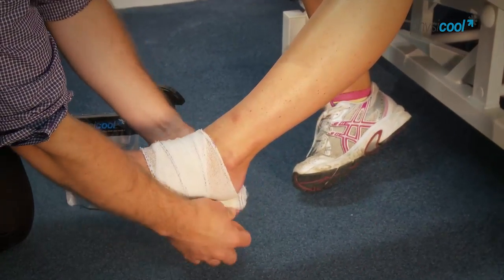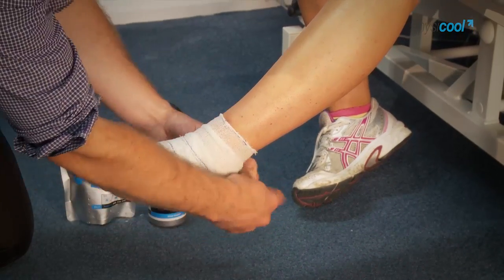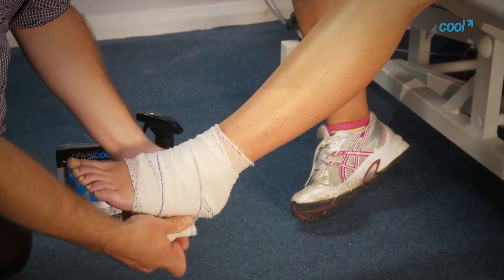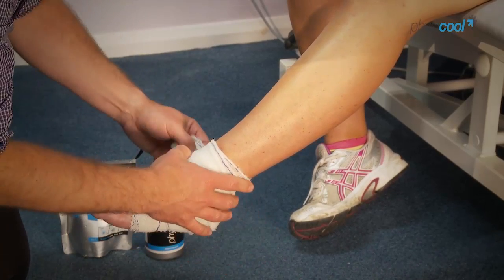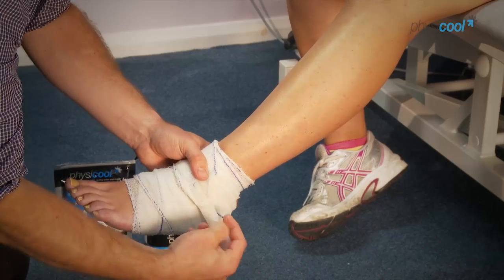Just overlapping slightly — it doesn't have to go on tight, just reasonably loosely applied. You can extend it as far up the leg as you want, and there are different sizes of these bandages available.